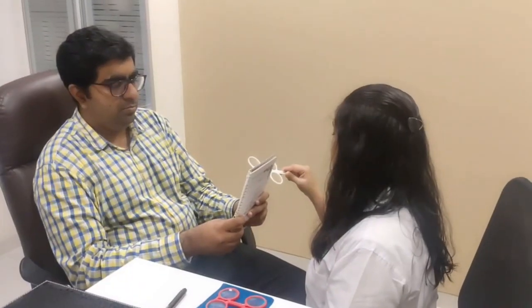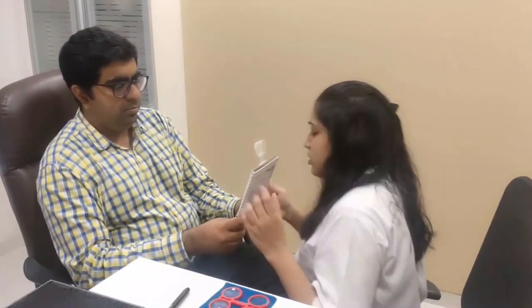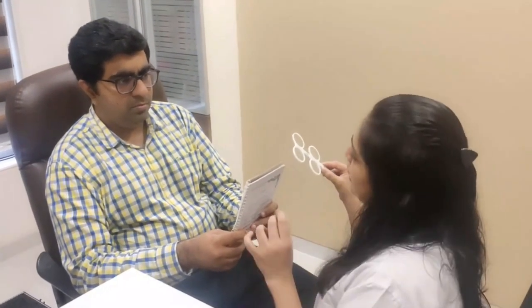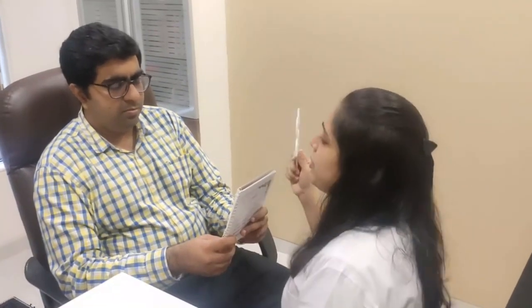Now we'll be checking the accommodative facility using the accommodative flippers of plus minus 2 diopters. Please look at the letters here. I will be putting some lenses in front of your eyes. Initially, the print will appear blur, then it will clear. Once it gets clear, you have to use the word now. Then I'll be flipping the lenses and another pair of lenses will be in front of you. We'll be doing this activity for 1 minute.